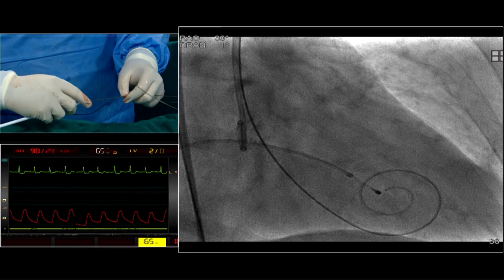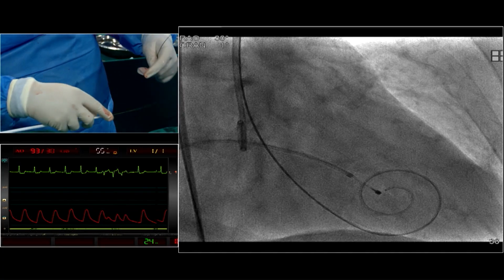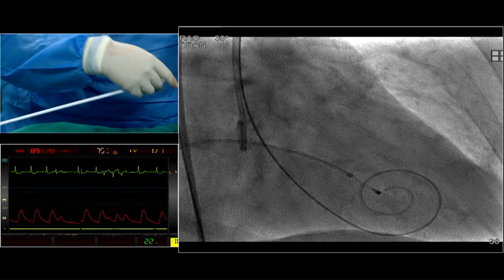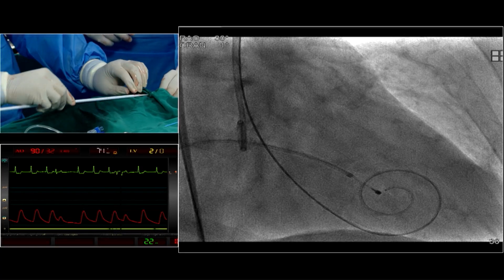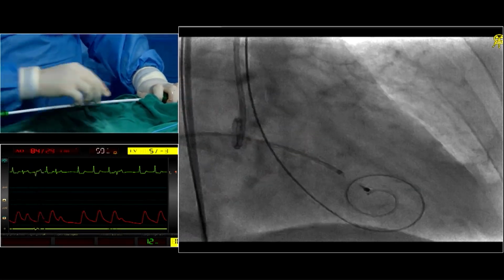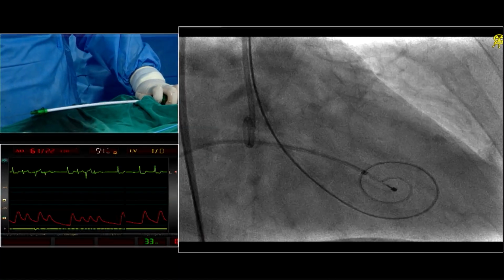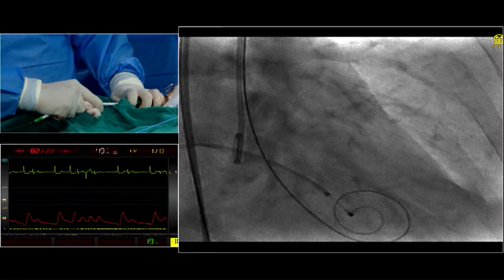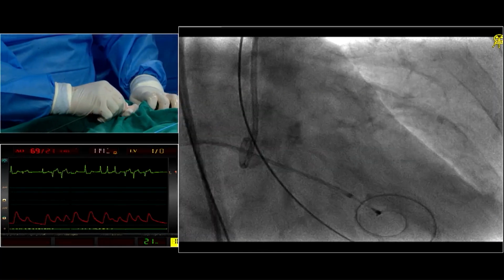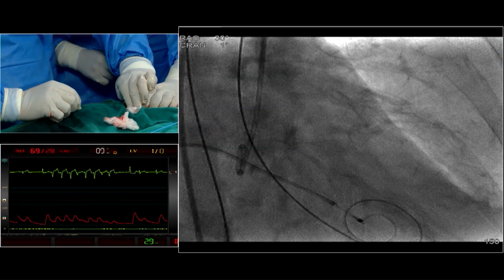Next, we are just going to prepare the sheath with an 18 French dilator so that the valve as well as retrieval of the valve becomes easy for us. It is sort of a preparatory move. So once this goes in, you can hold it with a dry gauze and go in. Of course, these are large femorals, so that should not be a problem. In small femorals, it might be slightly painful to the patient sometimes. So I pushed the dilator all the way in. Let's hold it. Now I'm going to take it out again.